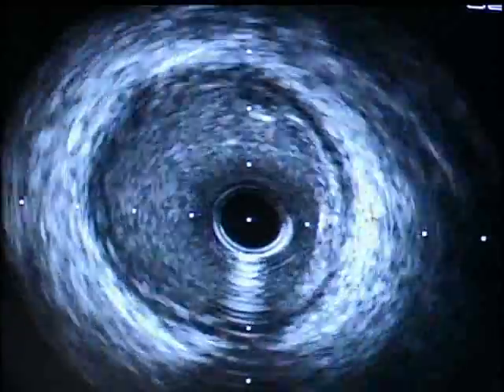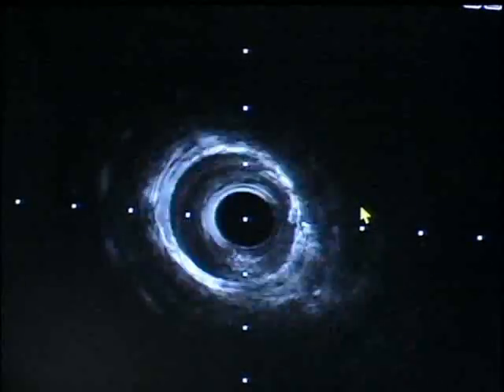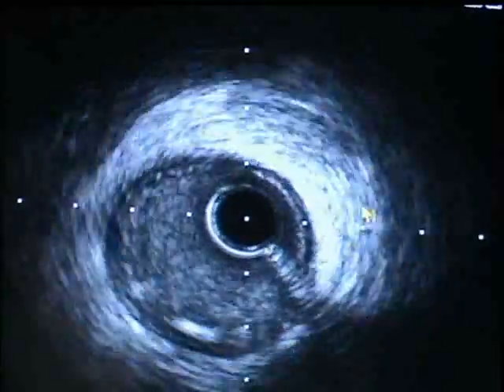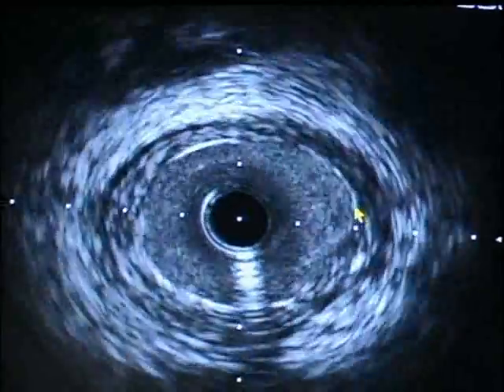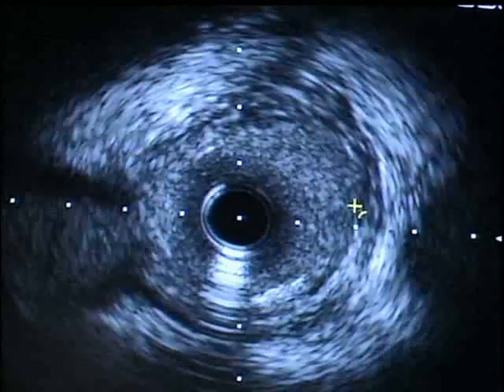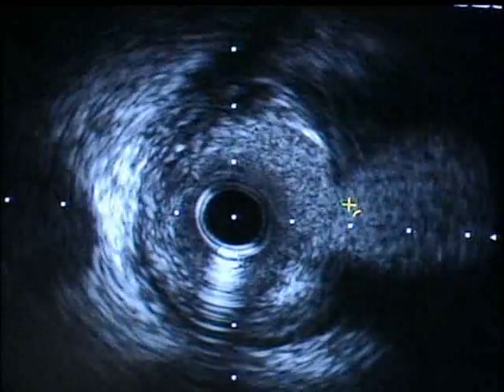I think we've finished, and we are coming into the distal left main. Okay, go back to where the distal left main was. So the point is, when you're doing an IVUS, bookmark the points where you need to go back for analysis. Sometimes when you're doing automatic pullback, it may require a little pause to analyze the segment carefully. And this is a Boston Scientific Galaxy IVUS, the iLab we have incorporated into three of our labs here.